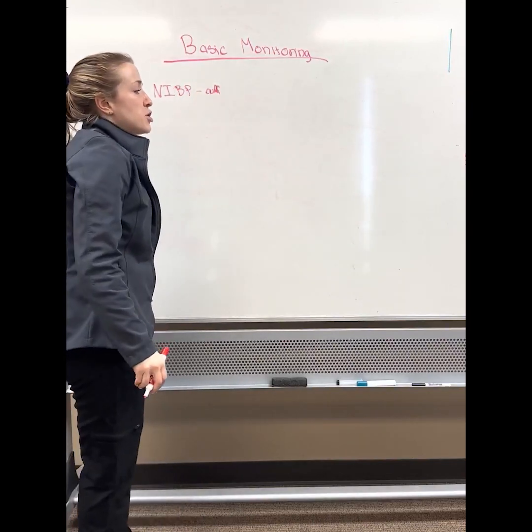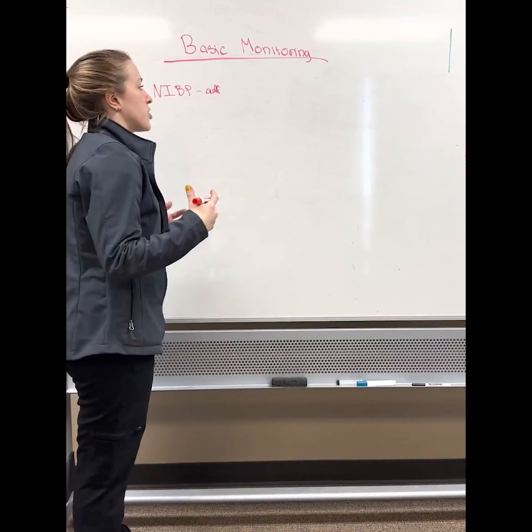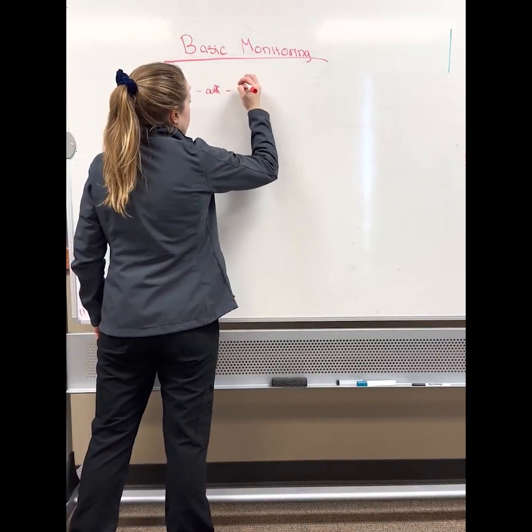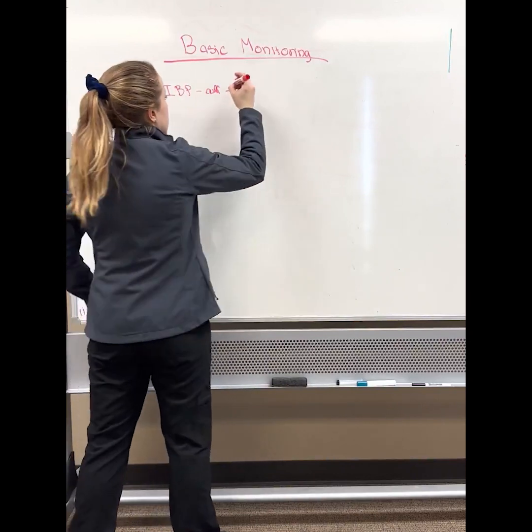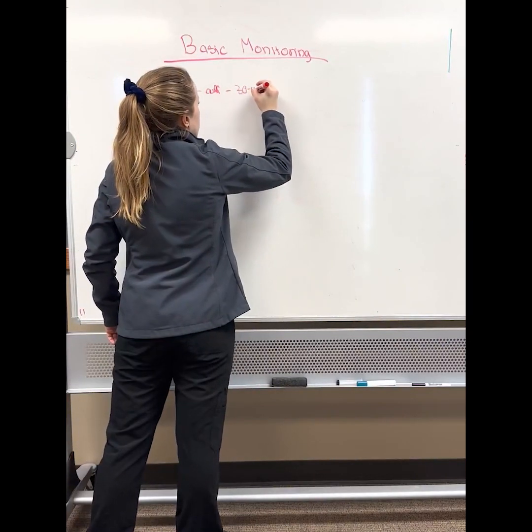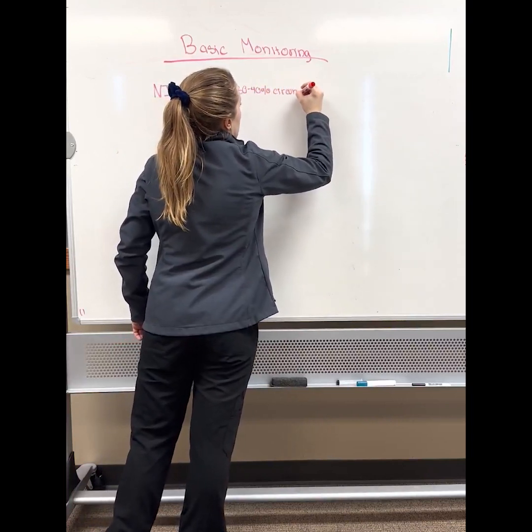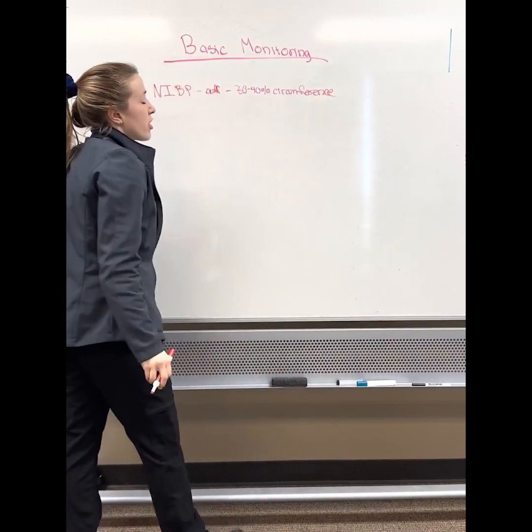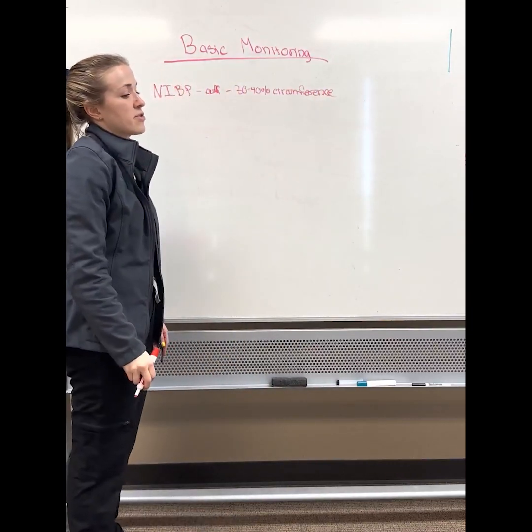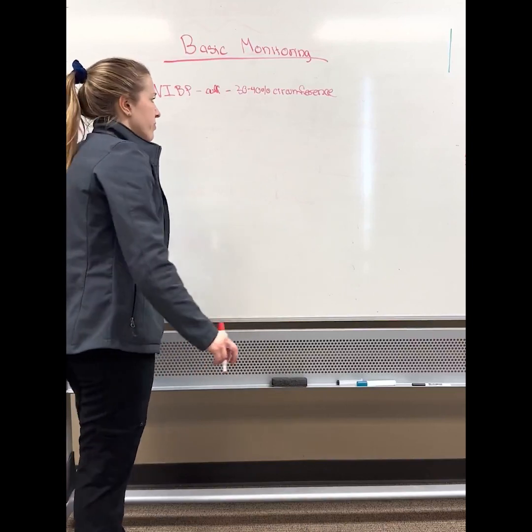The cuff is usually placed above the carpus or above the tarsus. You can also do it at the top of the tail. The cuff needs to be on its width. It needs to be about 30 to 40% the circumference of the animal's limb. And I will tell you that in clinical practice, pretty much no one gets out a ruler and gets the cuff size that's 30 to 40%, but just try to eyeball it.